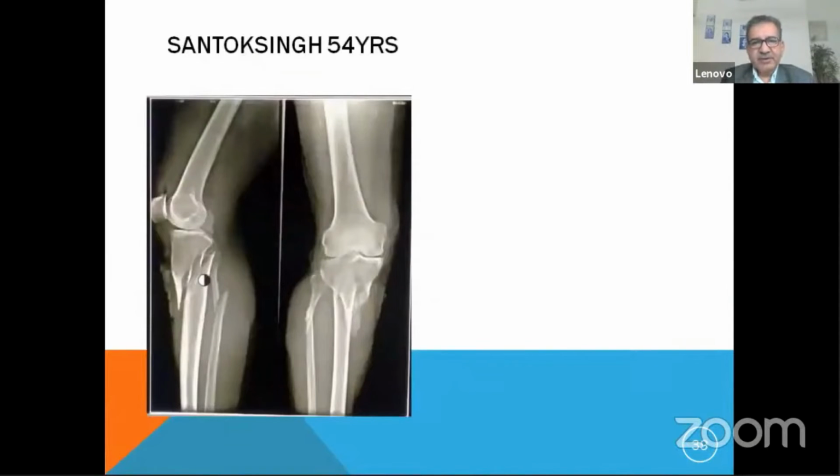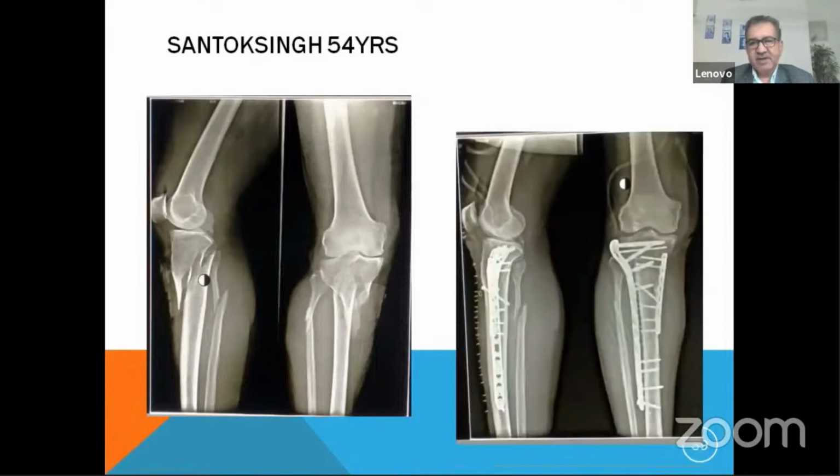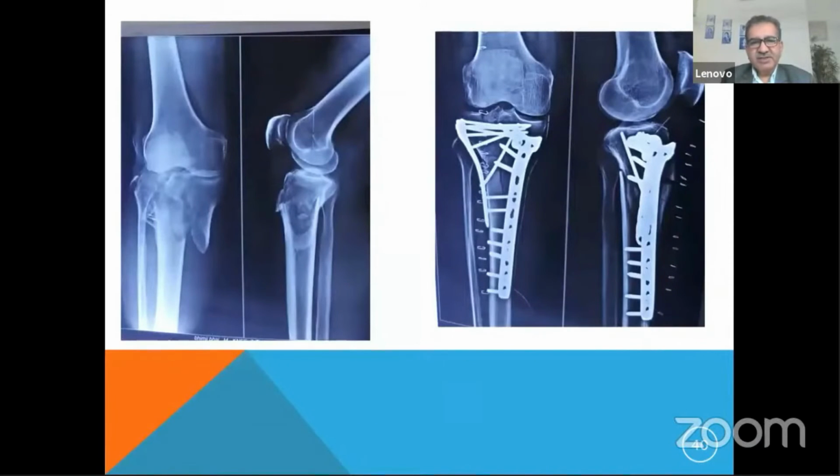This patient had a compound grade 2 fracture. Again, if the patient comes in the OPD hours and you can get the OT in the afternoon, you should take it within 6 hours. With a small plate and a larger plate, you can see a beautiful anatomic reconstruction and no problem with the healing. This patient also, when there's a large fragment, put a large plate on the medial side where the large fragment is, and a smaller plate on the lateral side.